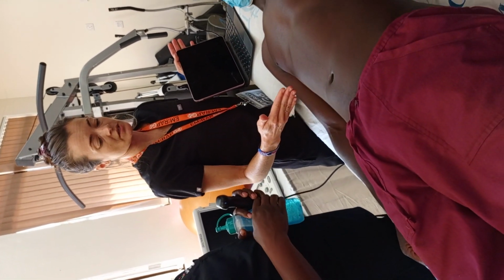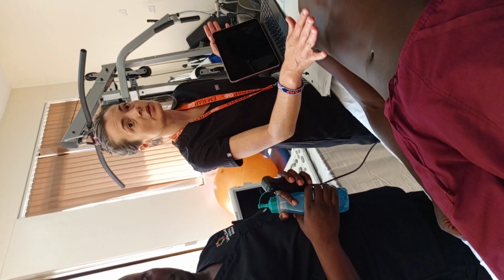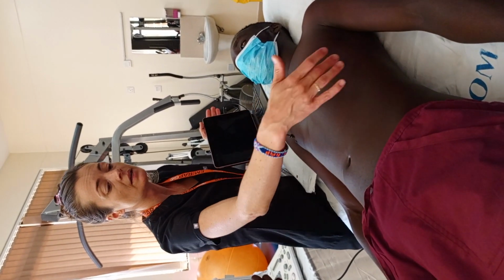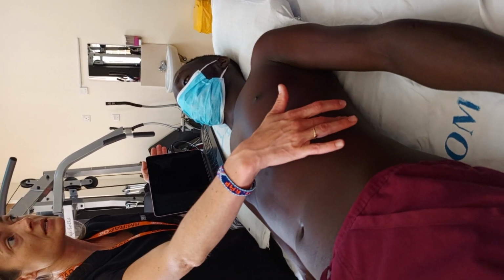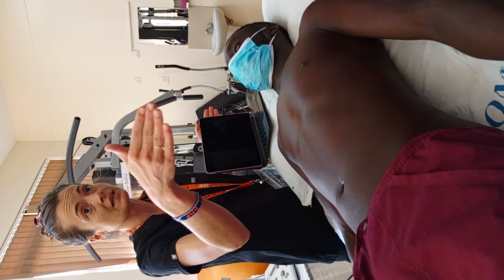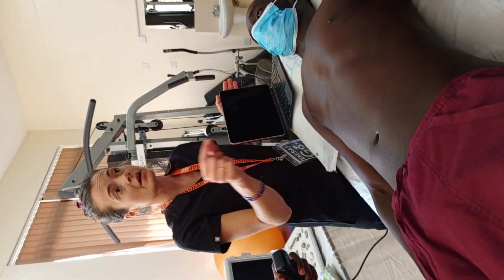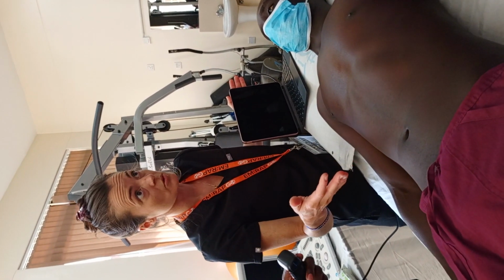The right upper quadrant is looking at the liver and the kidney. Subxiphoid is looking at the heart. We're looking for any free fluid around the heart or in the pericardium, so we're looking for any signs of tamponade. Over here, we have the spleen and the left kidney. We're looking for any fluid in between the spleen and the kidney. That's a potential space, just like the liver and kidney. There should not be any fluid there. If there is, in a trauma setting, I'm very worried about intra-abdominal bleeding.